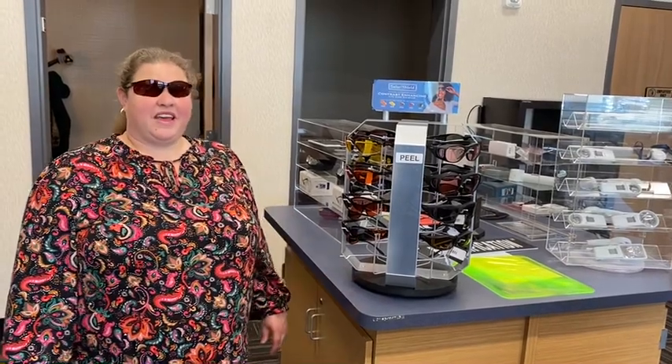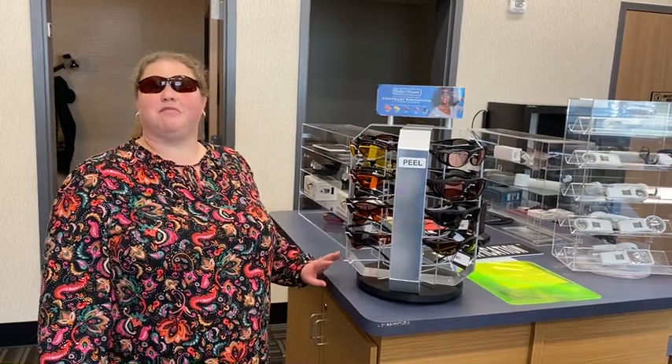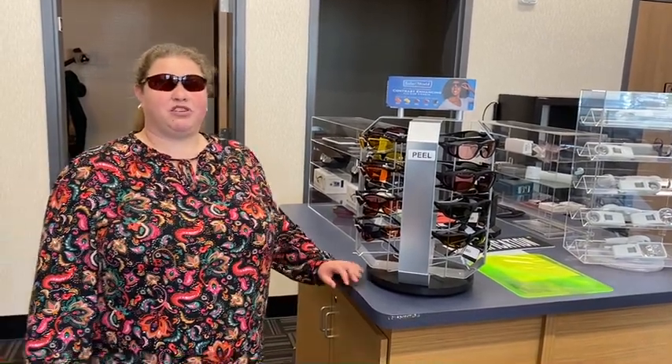Good afternoon! I am Taryn and we're going to do a quick episode of Store Shorts, which is long overdue. It's been a while since we've posted. We are carrying a couple of new things from Eschenbach now, and what I'm going to feature today is some eyewear — the different types of color shields.